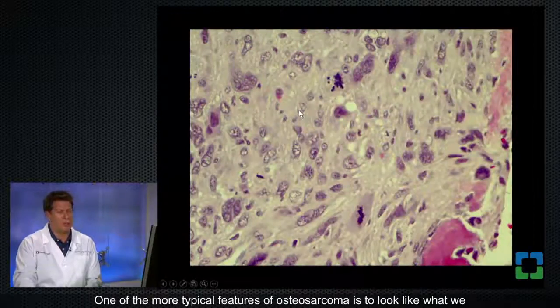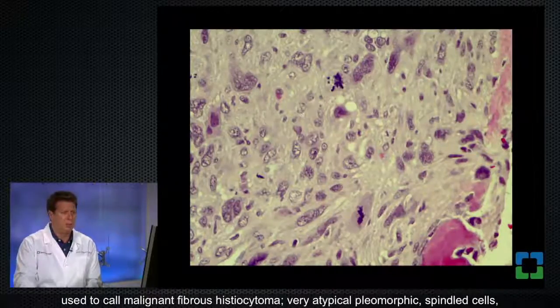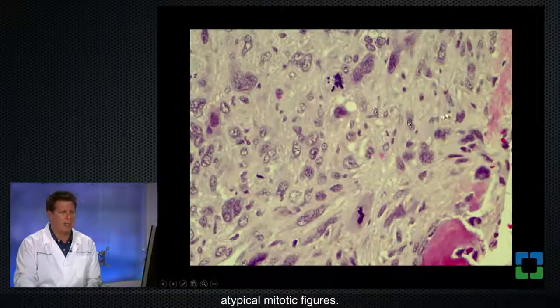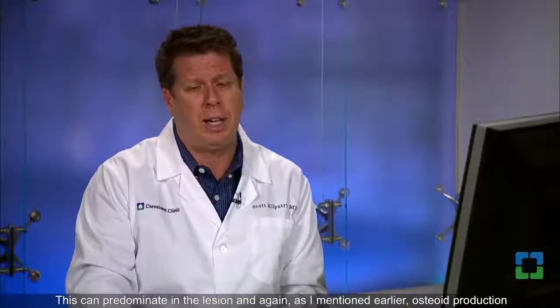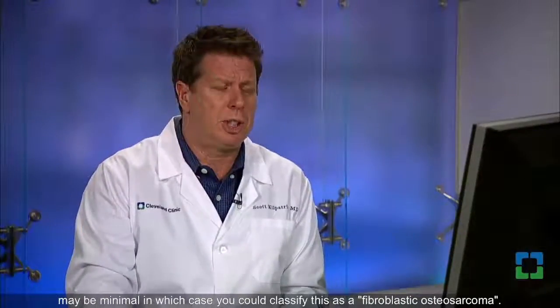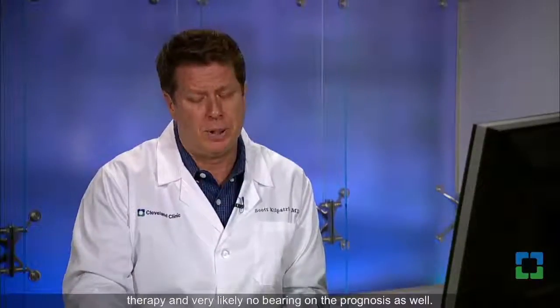One of the more typical features of osteosarcoma is to look like what we used to call malignant fibrous histiocytoma: very atypical pleomorphic spindle cells, atypical mitotic figures. This can predominate in the lesion, and again, as I mentioned earlier, osteoid production may be minimal, in which case you could classify this as a fibroblastic osteosarcoma. I should say up front that the subclassification of conventional osteosarcomas into fibroblastic, chondroblastic, osteoblastic types has no bearing on the therapy and very likely no bearing on the prognosis as well.